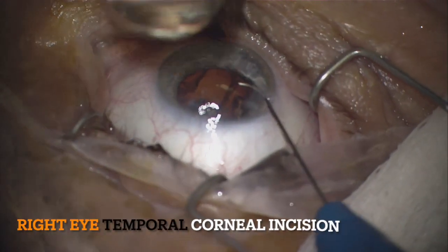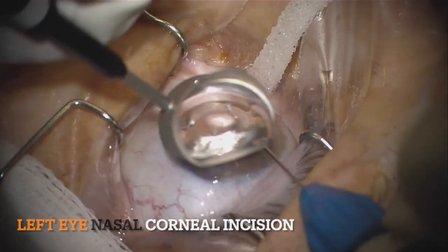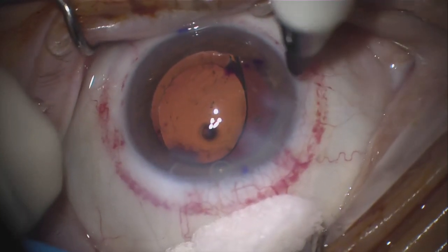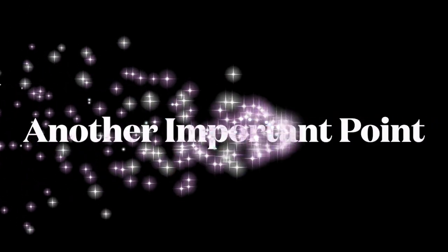Since my primary corneal incision and sitting position varies depending on the eye, a helpful tip is to mark the location on the cornea with a marking pen prior, so that one can line up with that spot when in the anterior chamber.